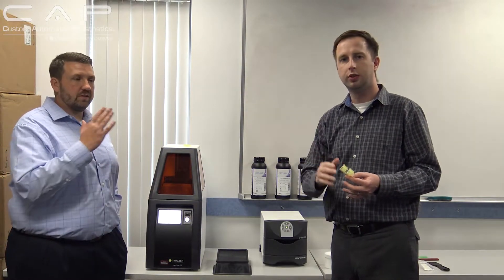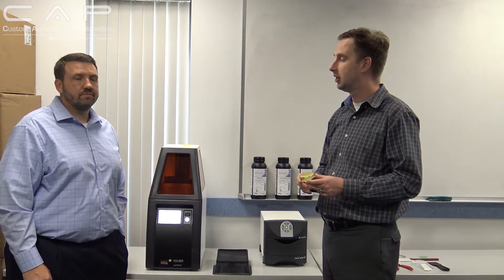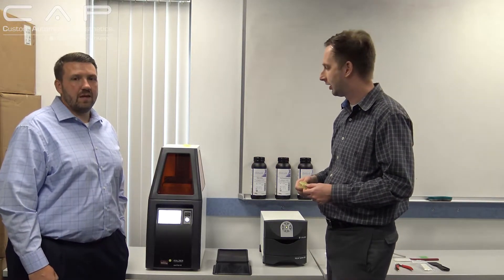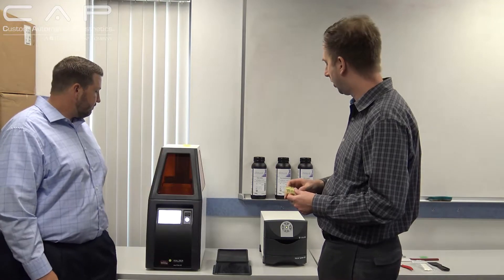And recently you did a print of six night guards, right? Yep. We were able to fit six on the build plate and it took about 26 minutes. 26 minutes to build six night guards — I mean, that's almost same-visit type speed. Absolutely. That's really, really incredible production out of the machine.